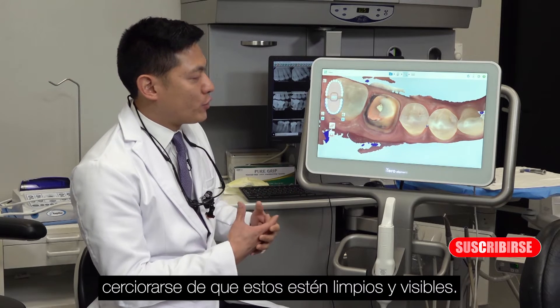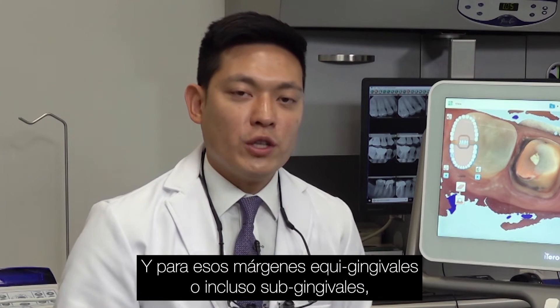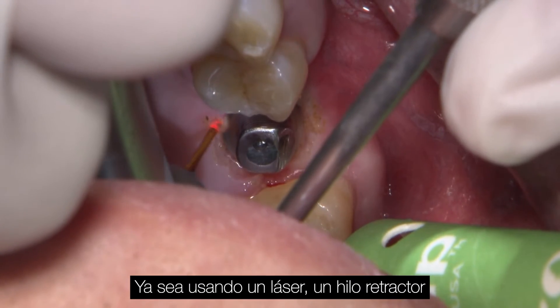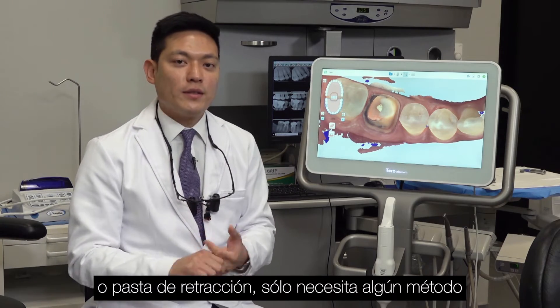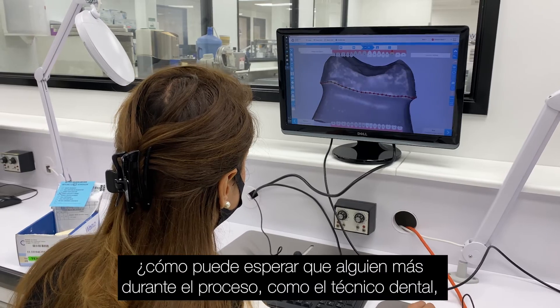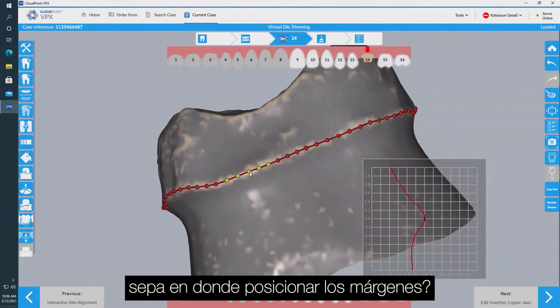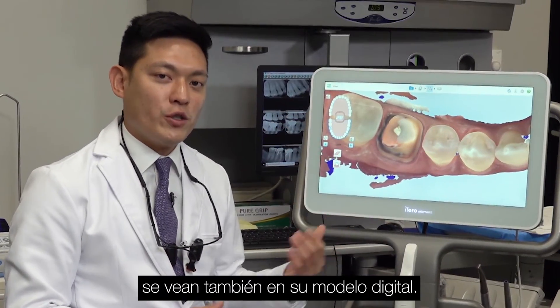Now for the margins, you want to make sure that the margins are visible and they're clean. For those equigingival or even subgingival margins, adequate retraction must be accomplished — whether you're using laser, retraction cord, or retraction paste — some method to move the tissue away from the prep so that the margins are visible. If you cannot see the margins at this point on your digital impression, how can you expect someone else down the line — the dental technician — to know where to position the margins? So it's going to be very critical that those are also visible within your digital model.